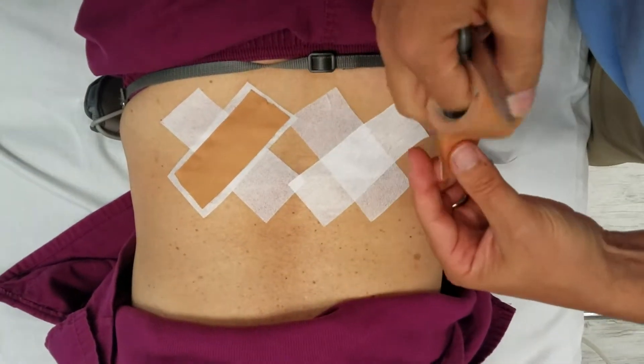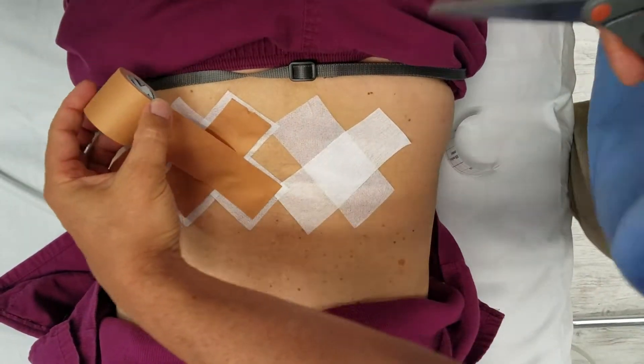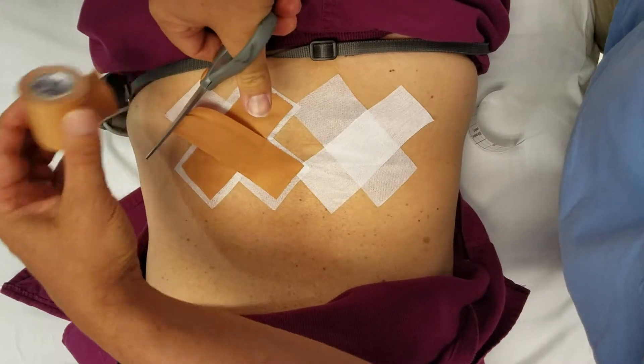This little bit of tape is more supportive than a lumbar belt or most other supports, because it actually does significantly prevent that lumbar flexion.